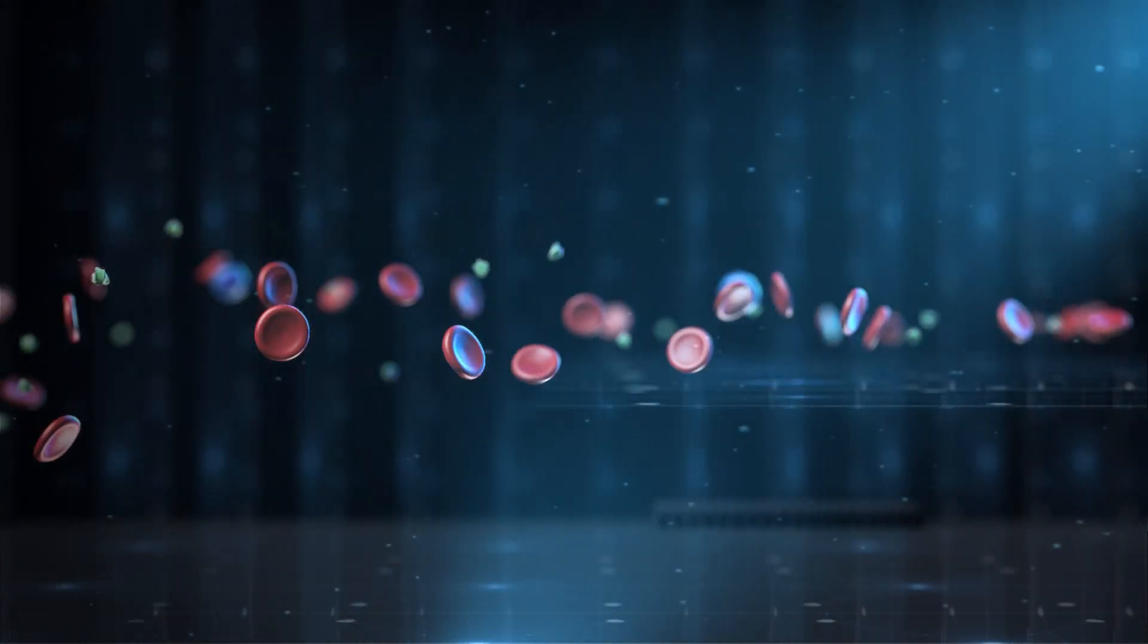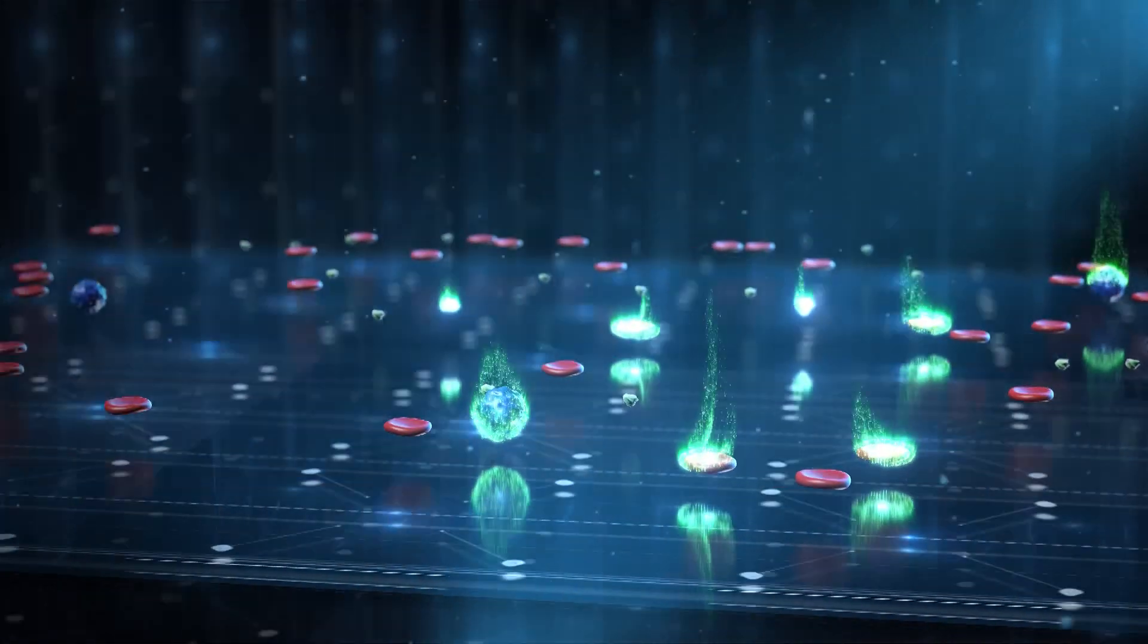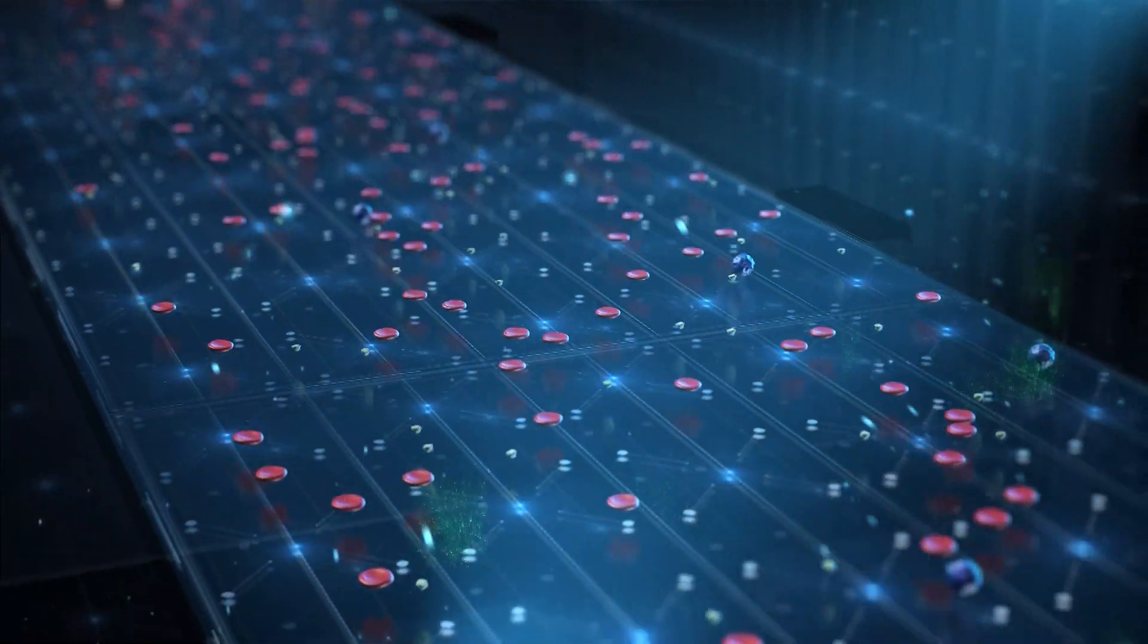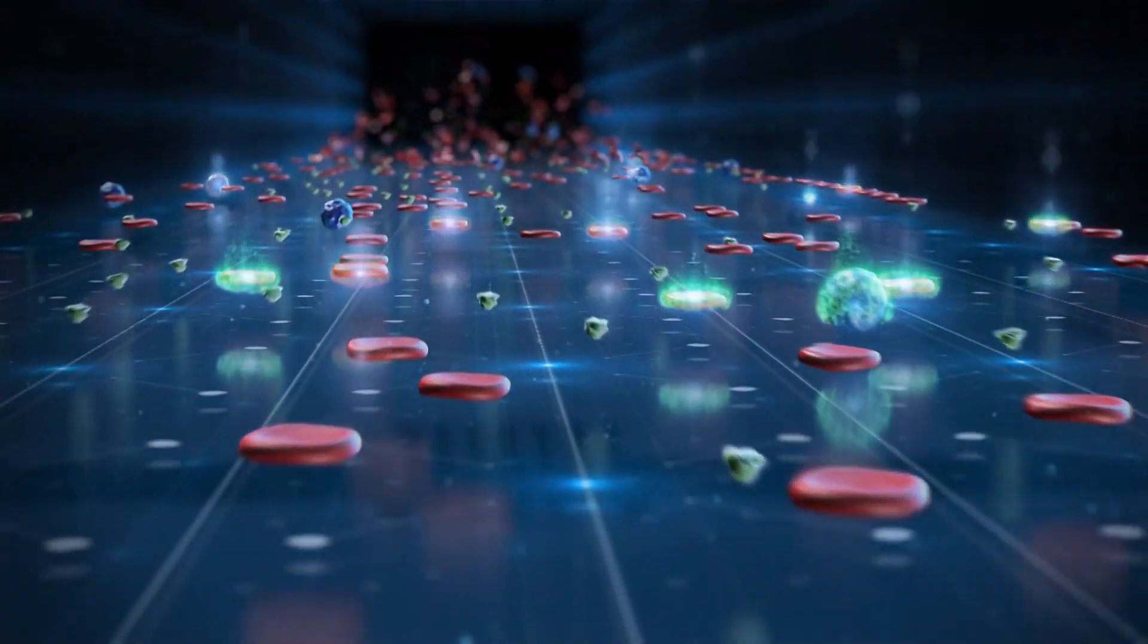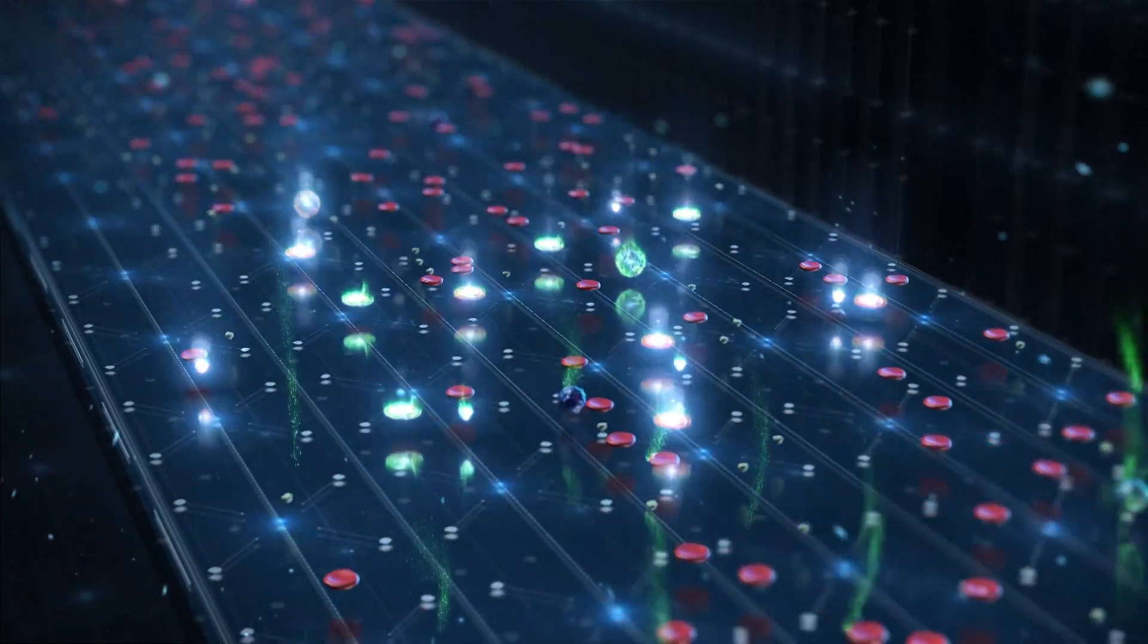The blood flows through a micro channel while cells focus at the center and form a single layer plane. Images of the focused cells are analyzed using cutting edge machine vision algorithms. Cells are differentiated based on their morphologies and staining properties.